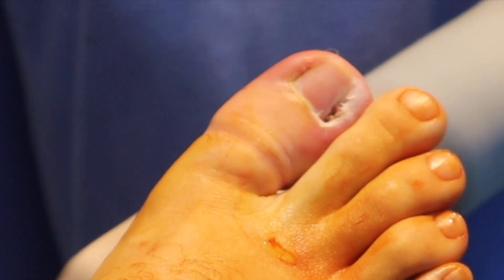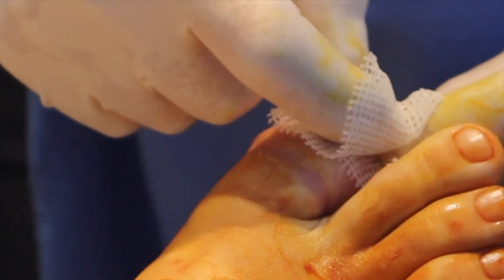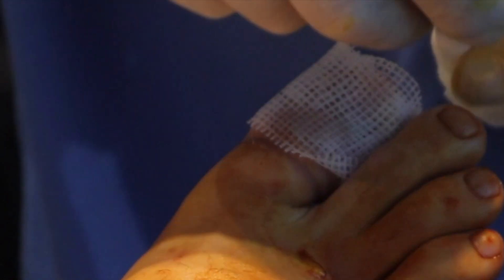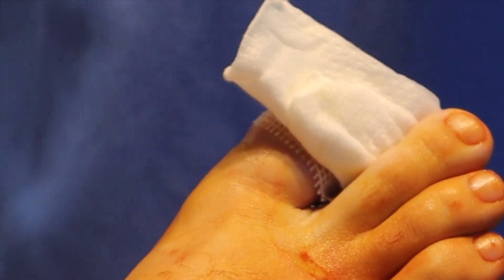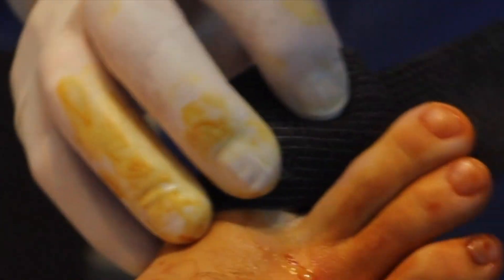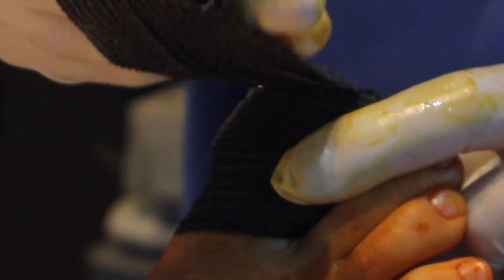This is just Bacitracin antibiotic towel to protect that area, and some three-by-threes. We're going to wrap this with some co-bend overnight, and then he'll be soaking in warm water and plain vinegar and putting Polysporin on.